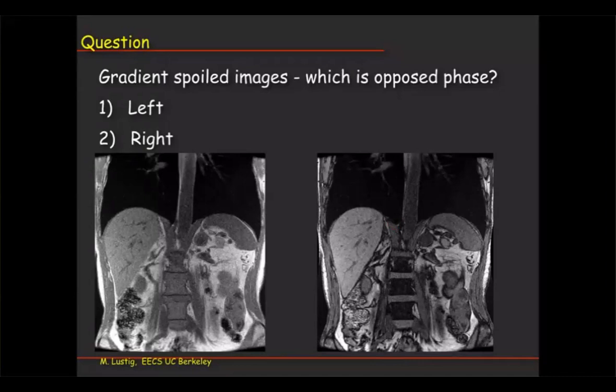I'm just looking right around the, I don't really know how to point to it. I'm just looking at that one spot, but kind of move to the right a little, and up a little, there's a difference. Yeah, you see contours, right? Basically, when you see contouring around tissue, and the fat is usually brighter in T1, then if you see contours, that means that it's opposed phase.